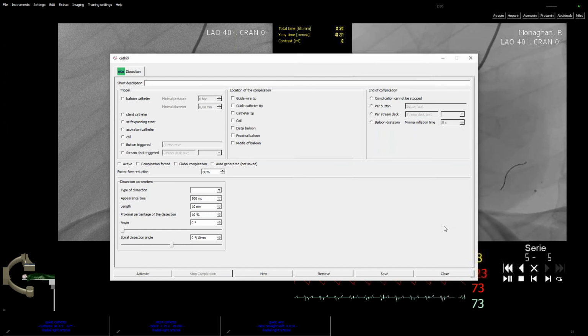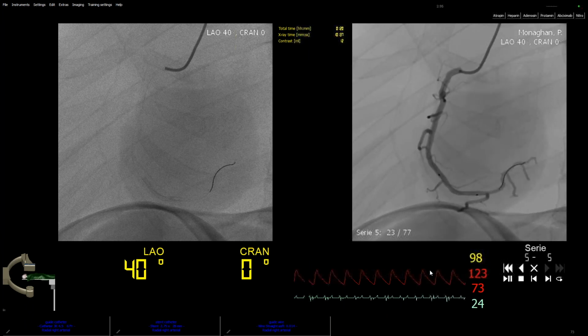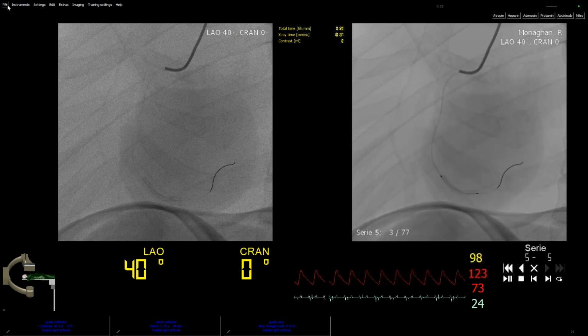Thank you, Doctor. I received a question about the Coro 3D. We can move to it after we finish the case, but does anyone have another question regarding the case or the software itself? We can move on. Someone is asking if you can show the Coro 3D. So I will close this one and open the Coro 3D, and we can take the audience through it quickly.